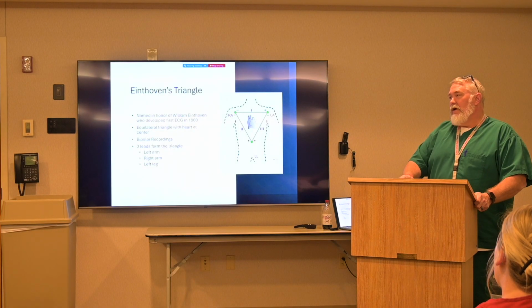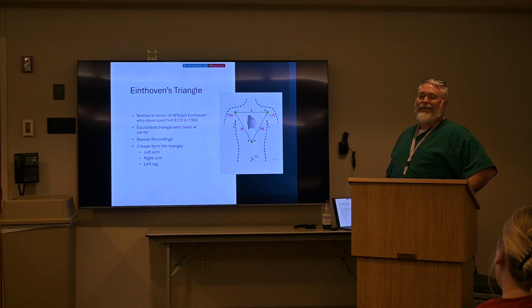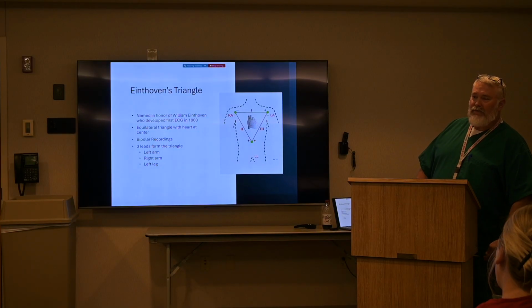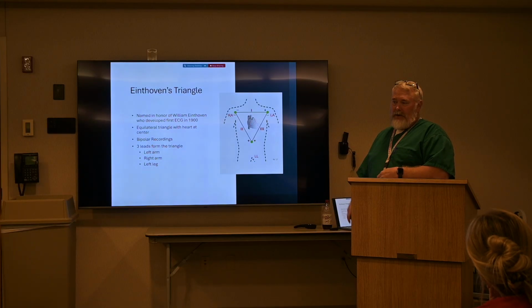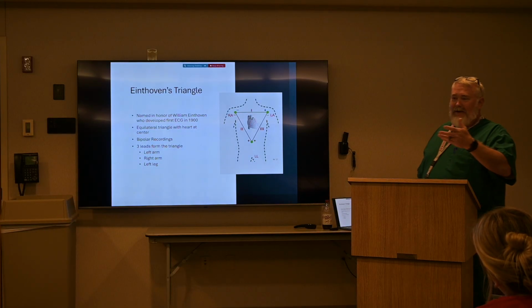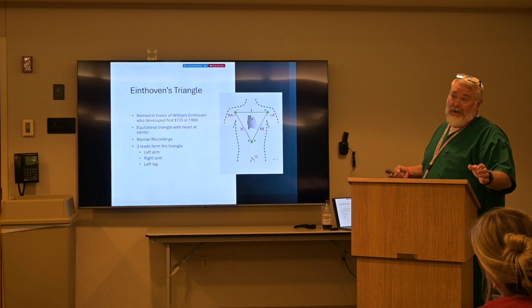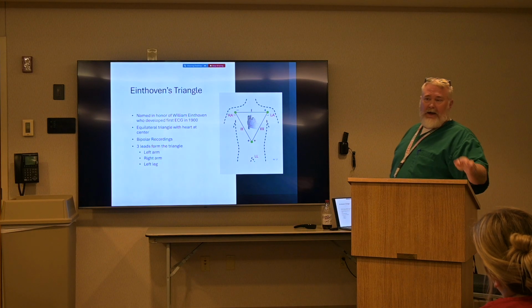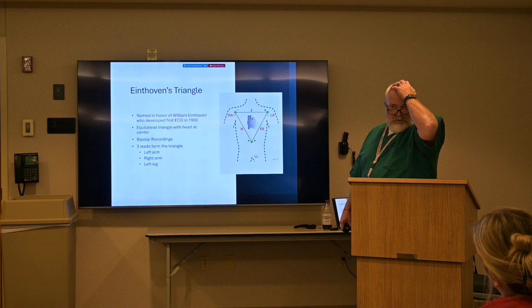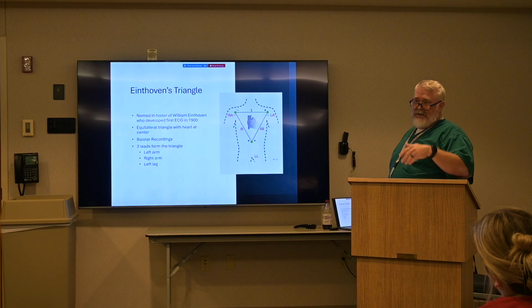I mean, you can put them up high. You're just not going to get as good conduction as you would if you got to a smaller area of muscle volume. So the answer is kind of yes, you can, but it just depends on what information you're wanting to get out of it. Plus, if they're really bony, it makes a difference too. Yes, exactly. In the ER with some larger people, even getting them to read at all. Yeah, exactly. You deal with artifact and everything else.